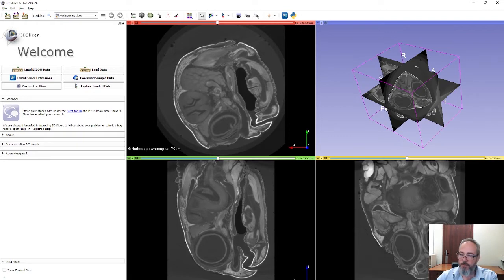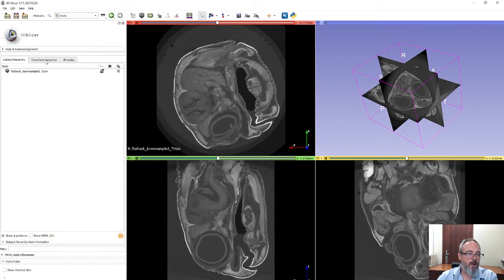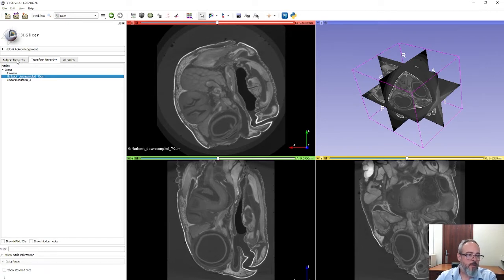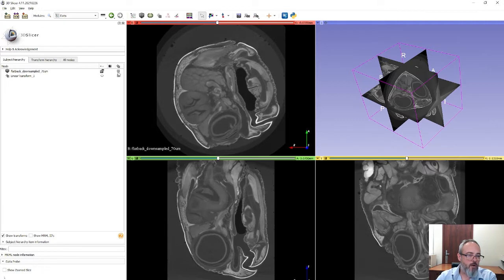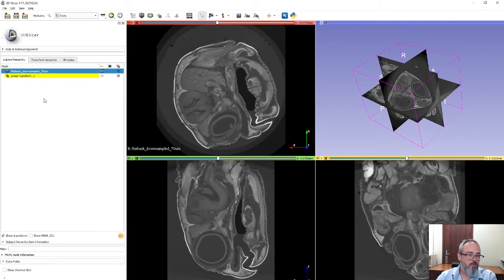Next step: go to the Data menu in the modules, go to the Transform Hierarchy, and on the data right-click and insert a transform. You now have a Linear Transform. Go back to the Subject Hierarchy, right-click on the little grid icon on the data, and set it from None to Linear Transform, which attaches this linear transform to the data.